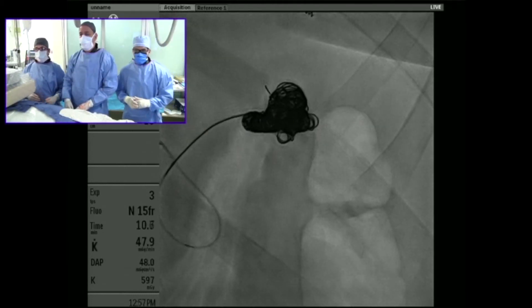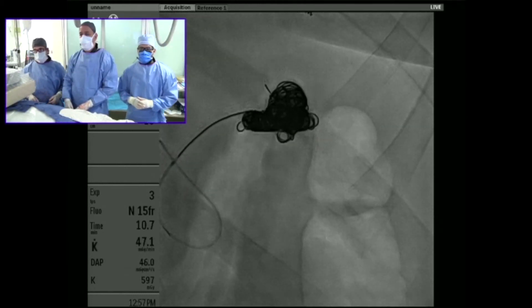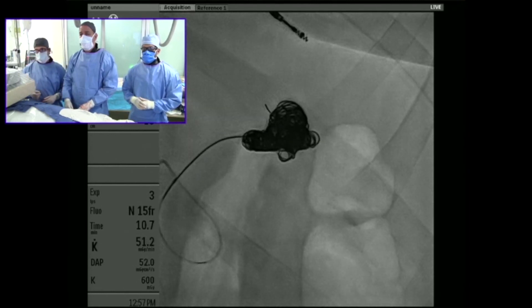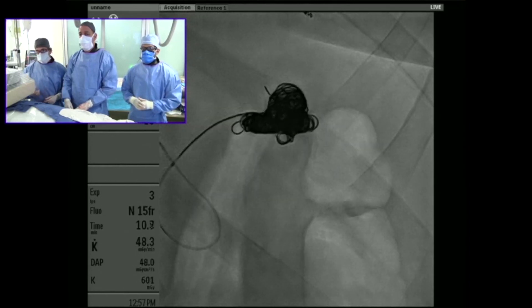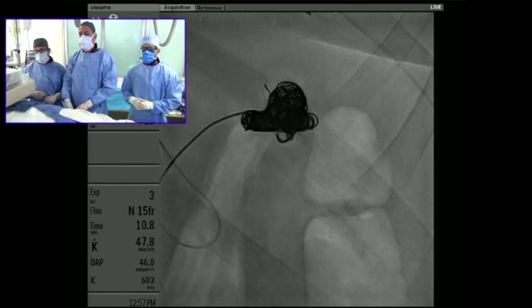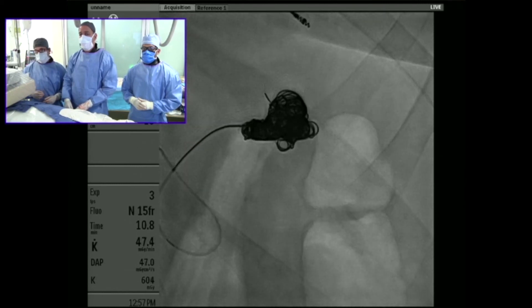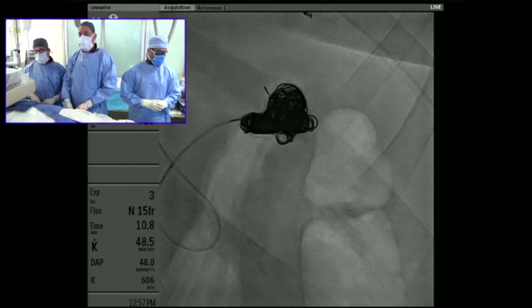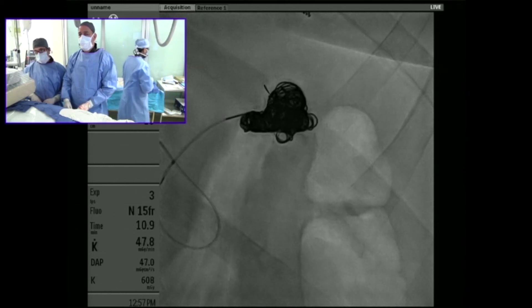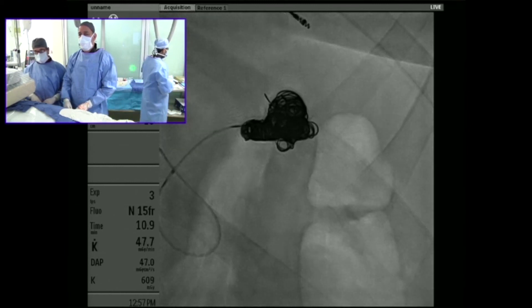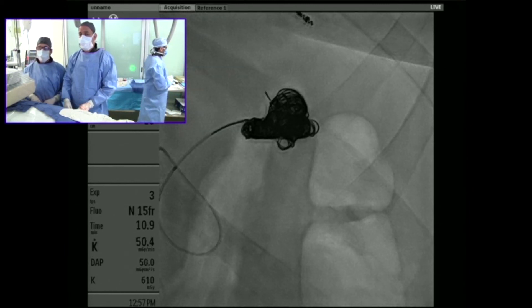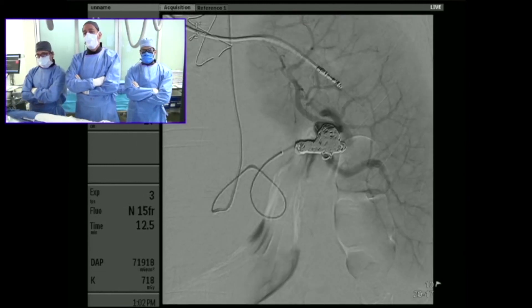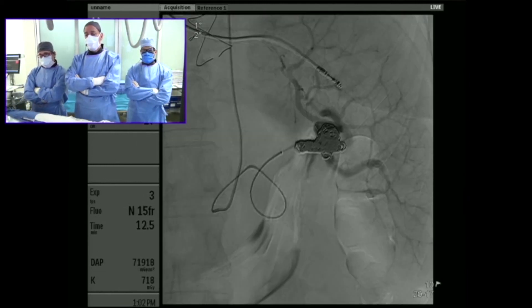She is on Coumadin, so we want to keep this packed very tight so it will thrombose. If you look at this last coil being deployed, it's forming a nice dense plug. What will ultimately help thrombose this is the inflow plug. One or two more coils should be exactly what we need — if we see a little more stasis of flow in the proximal vessel, I'll be happy to stop. For this particular case, I think we're okay.